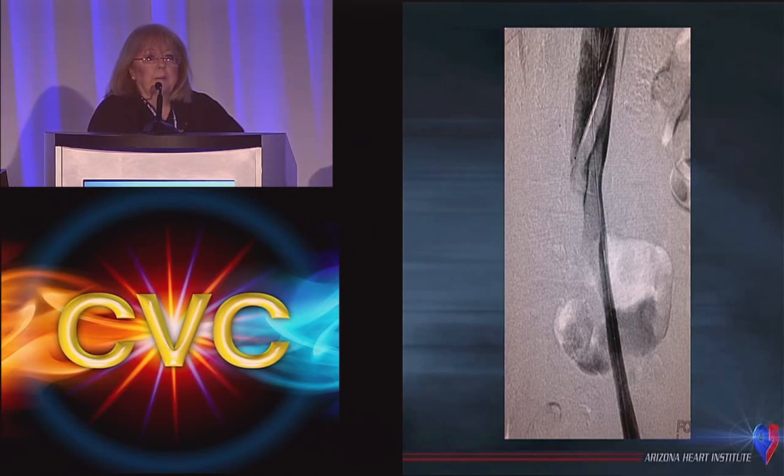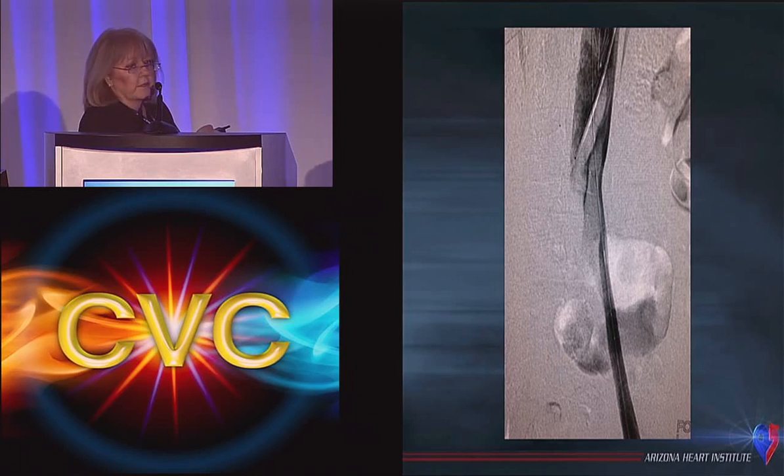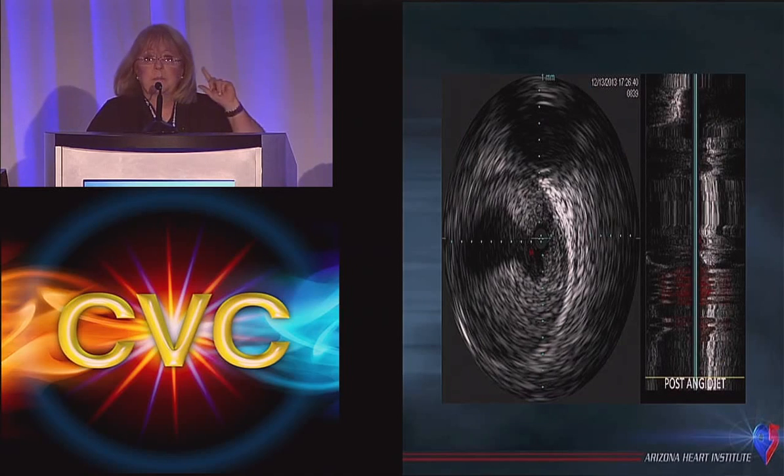I'm coming from the popliteal direction, thinking I'm going to treat this young woman with bilateral popliteal trellis and lytic therapy. And I must confess that I did, in fact, put an Optease filter in her from the popliteal approach, which requires a 90 centimeter 6 French catheter sheath to push it from the popliteal, because it doesn't come with that by itself. But there is, in fact, a filter there.